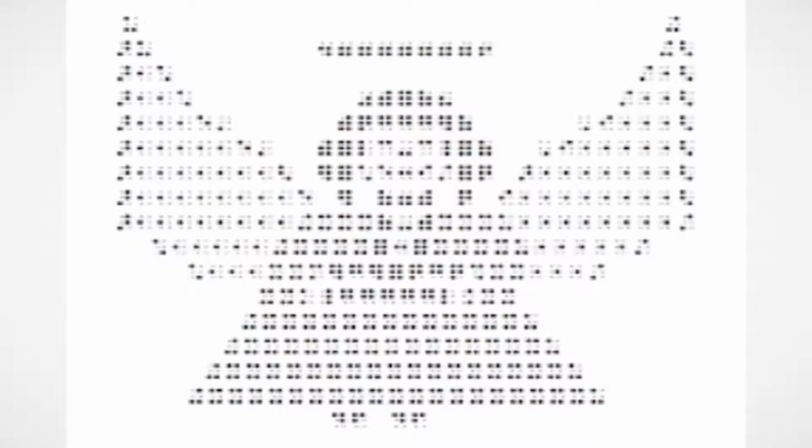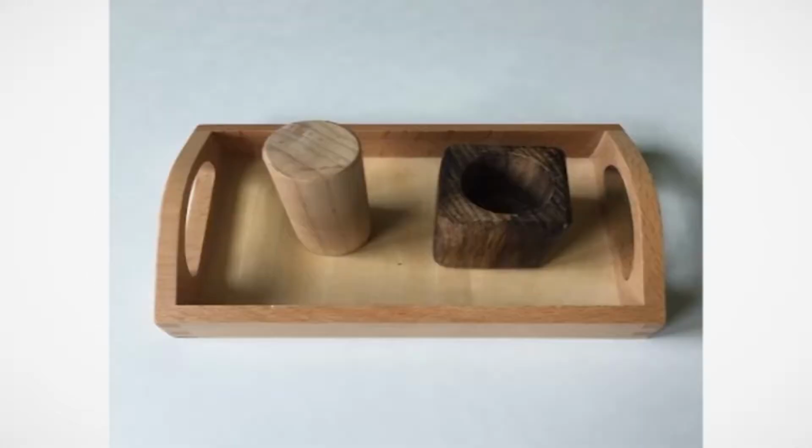Peg slate is a paperless device designed to help teach beginning users of the Braille slate. A frame is mounted with pegs that represent the Braille dots in 10 Braille cells. A finger is used to push the pegs down. The frame is then flipped over to read the Braille message.